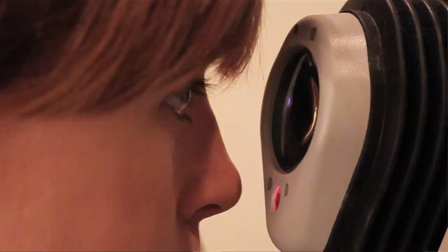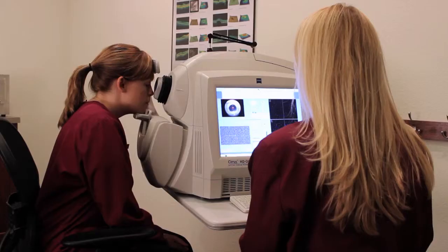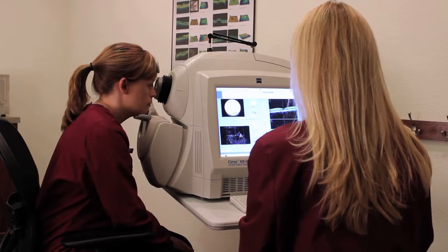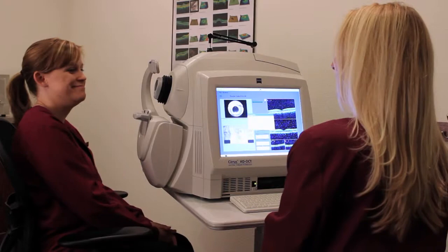Let me put your chin right here, forehead against the bar for me. Very good. You will feel me move you around just a little bit. Now, do you see the green star that is inside? I am going to have you look right at the very center of that for me, please. And blink twice. Try not to blink, try not to move. And you can go ahead and sit back, thank you.